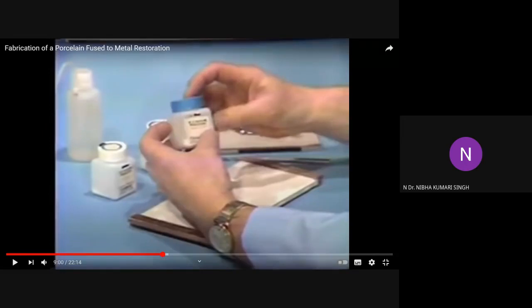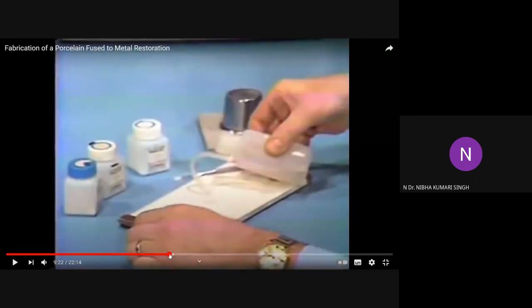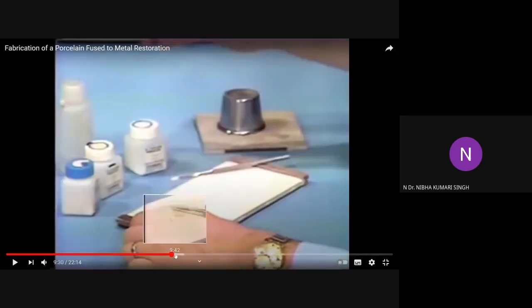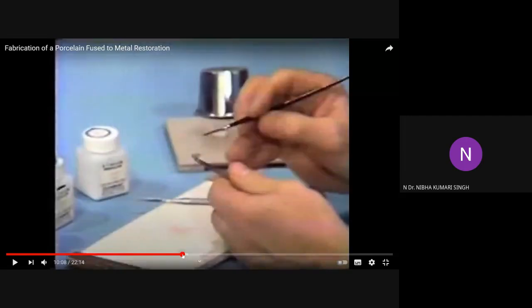After that oxidation, these are the ceramic powders which are available. These ceramic powders or kits are available in different forms, like opaque porcelain, body porcelain or dentin, shoulder porcelain, gingival porcelains, incisal porcelains, and glazes. After the oxides are formed on the surface, you have to apply the opaque porcelain. You can see the armamentarium used. It is just powder particles mixed with a special liquid. These powder particles in liquid form a plastic mass, which is applied with the special brushes available for ceramics.